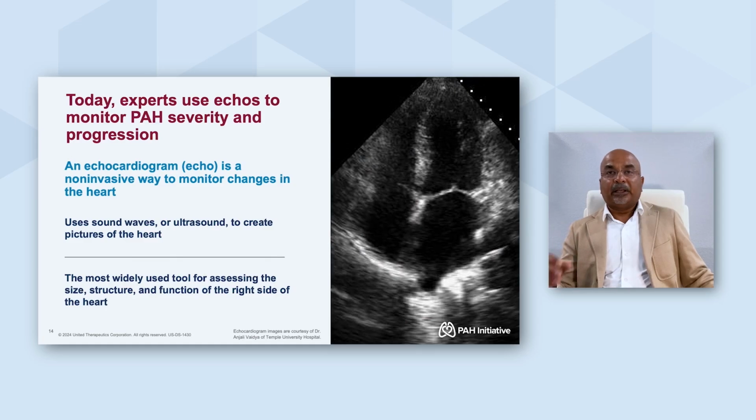And then the other important test is the echocardiography, which is basically an ultrasound of the heart, where you may recollect this test where they put a gel around your heart and they put a tight pressure on the probe and they kind of go around the heart to see the images of the heart. But obviously, when there is pulmonary arterial hypertension, the blood vessels within the lungs are narrowing, and this is behind your chest, and there is no direct way of measuring that apart from doing a right heart catheterization, which will give us that information very accurately.